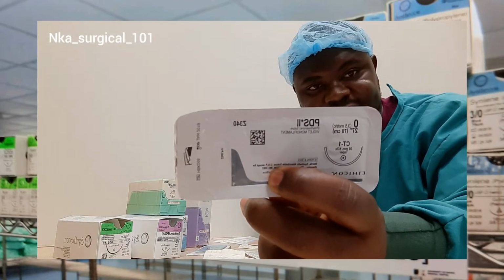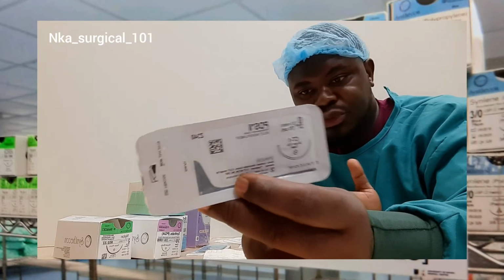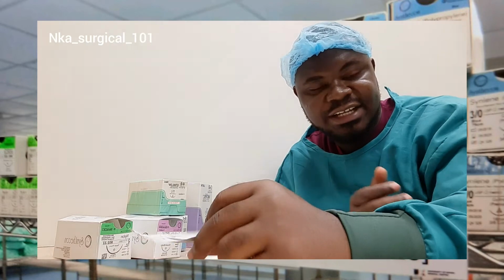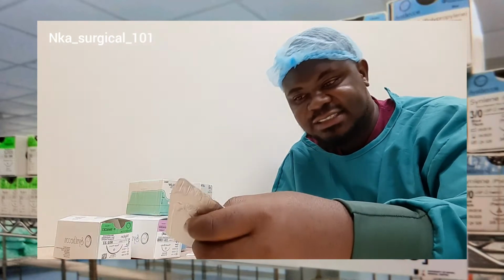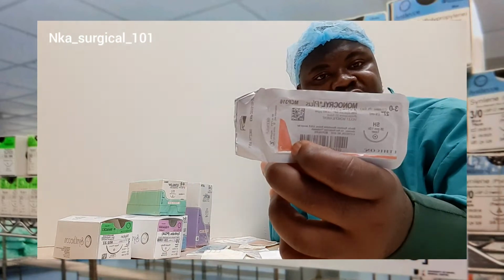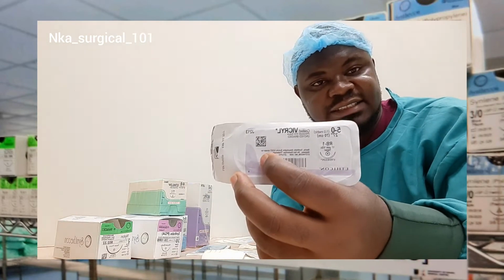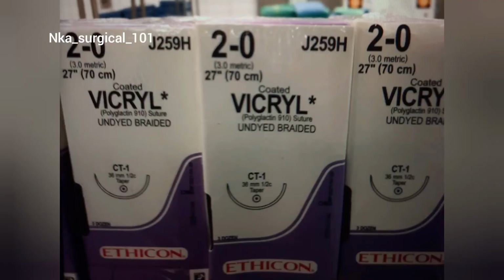So sutures, absorbable and non-absorbable. When you talk about absorbable sutures, we have synthetic and natural, and under synthetic we have the PDS, the monocryl, and then the vicryls. They all fall under the synthetic absorbable sutures.